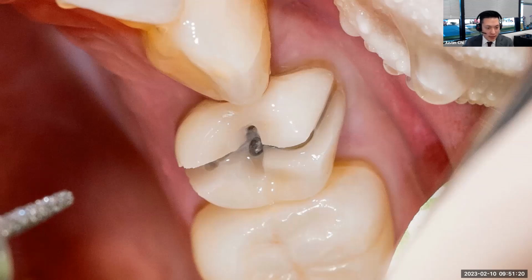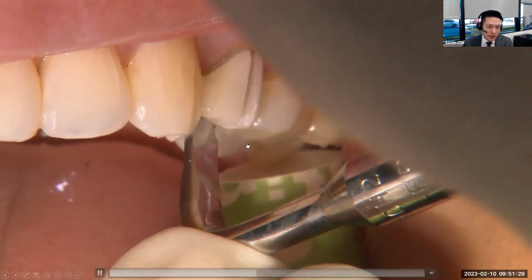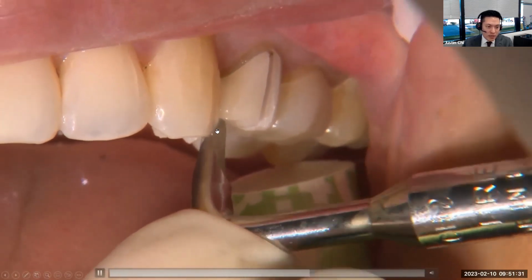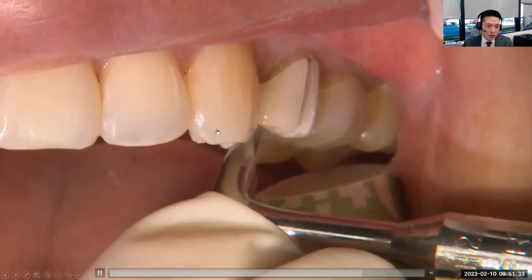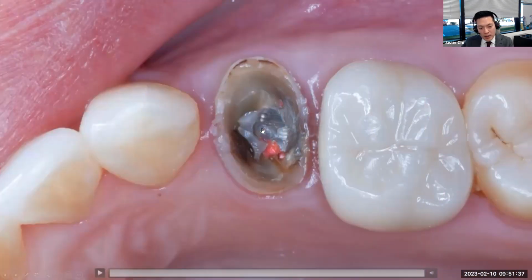This slot is intended for me to position a Christensen crown removal tool. We're going to place it from mesial to distal and just give it a little bit of force with a twisting action, so that I want the restoration to break off to the buccal or lingual. I'm trying to minimize the forces generated mesiodistally.